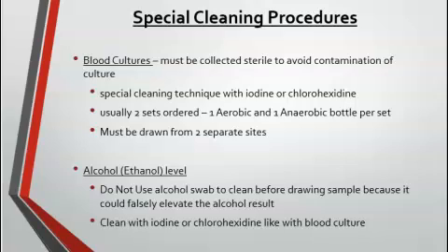So we must also clean with iodine or chlorhexidine, just like when we're cleaning for blood cultures, if we're collecting a sample for alcohol or ethanol testing. If we were to clean the site with alcohol and then collect a sample for alcohol ethanol testing, guess what? It can falsely elevate the alcohol results.